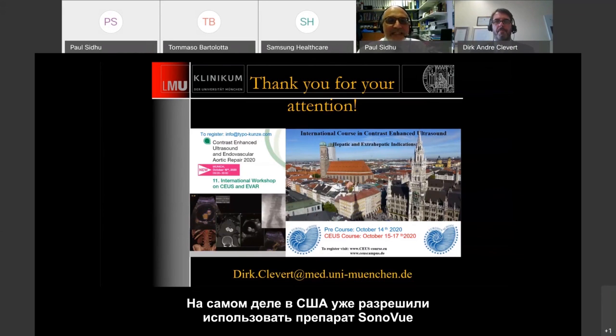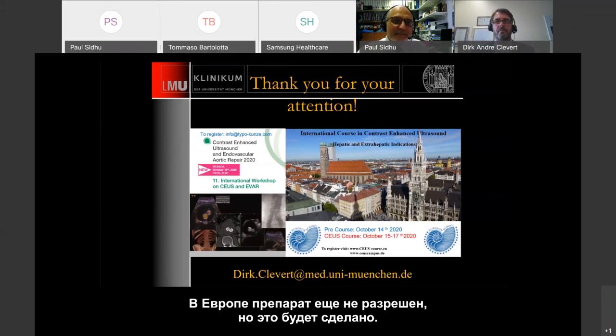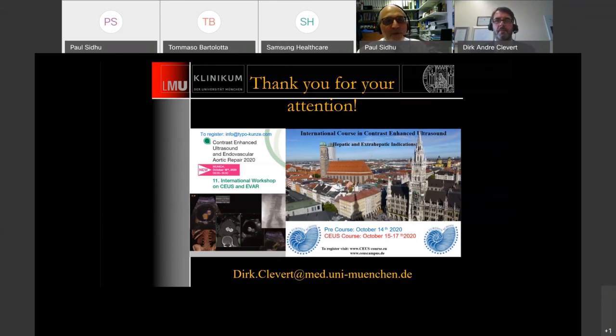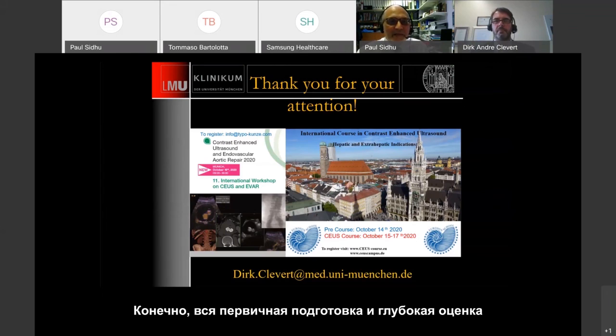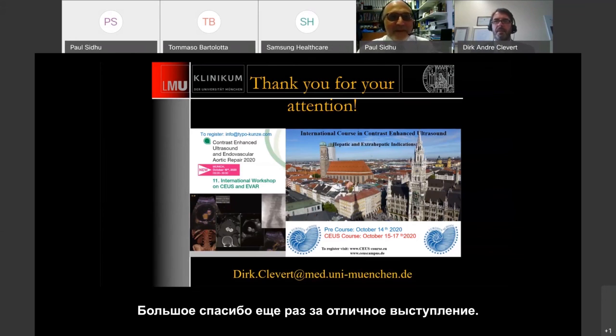In fact, the United States has licensed SonoVue, or Lumason as it's called, for intravenous use in pediatric patients for focal liver lesions. It is not licensed in Europe yet, but it'll come. But of course, all the primary work and all the in-depth assessment has already been done in Europe. So we are ahead. I have no more questions, Dirk. I need to say thank you very much for a good talk.